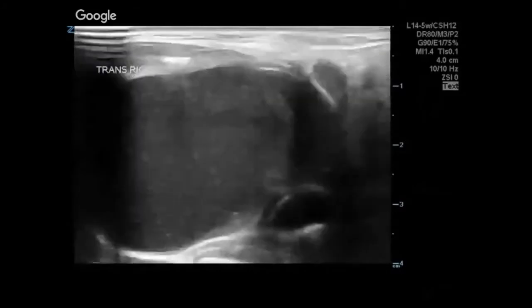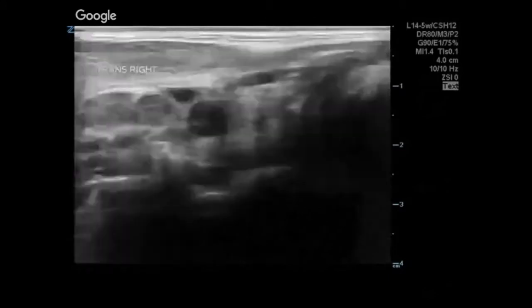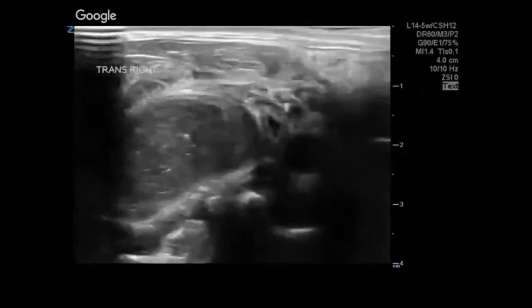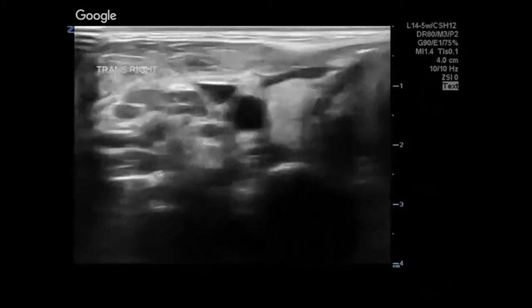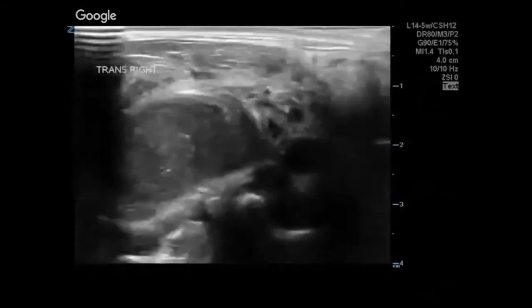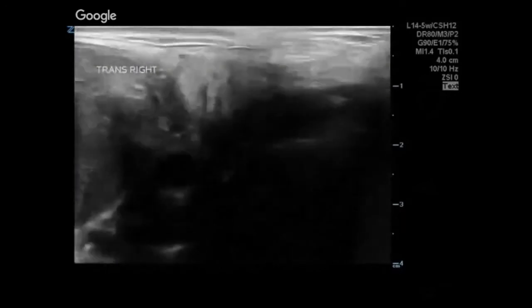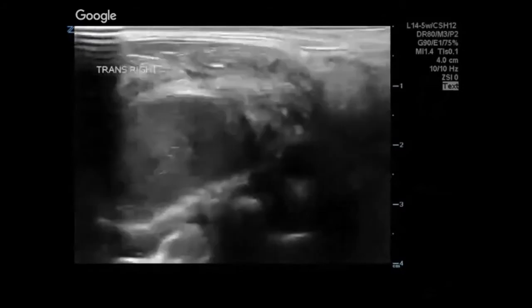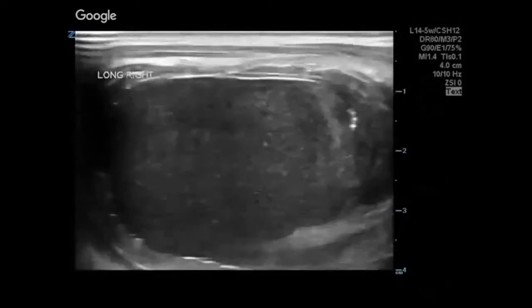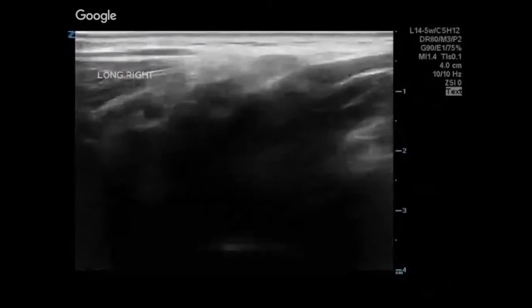We don't see a central hilum. We don't see the normal architecture of the lymph node, like the follicular centers inside. So it looks like something different. It looks very homogeneous inside, which again doesn't look much like a lymph node. And it would be coalesced lymph nodes if it was all in that area. It would be one structure. Here it's just the longitudinal axis of the mass. But exactly, there is no hilum.